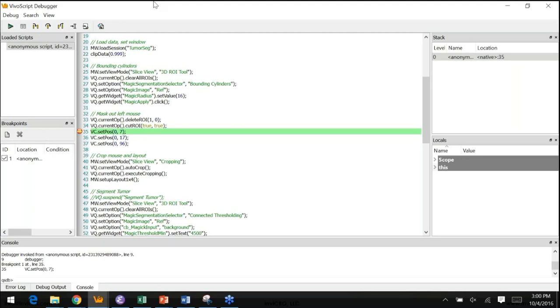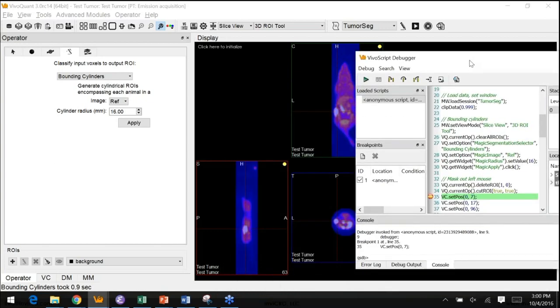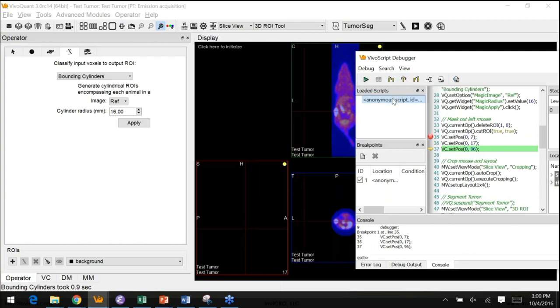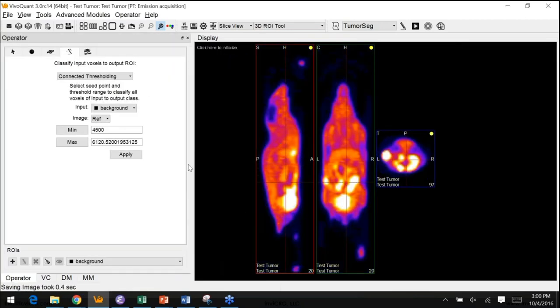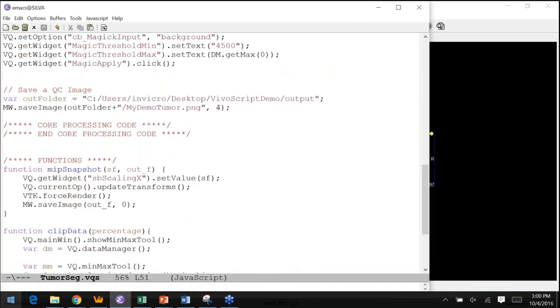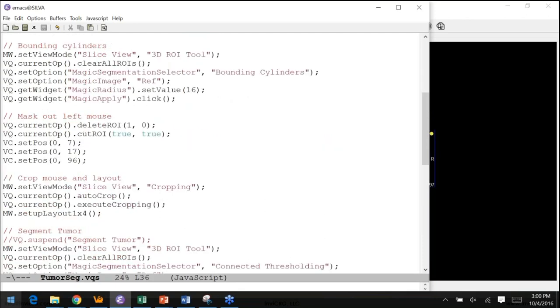Okay, it paused here. Made it really tiny. So that's actually looking pretty good. It set that part in there. Let's see what happens to the other ones. Step over, up. You see, it's moving the crosshair. It's a little hard to see on the projector, but it's moving the same dimension. Obviously, that was my mistake here. You've provided the dimension as the first argument. They're all 0. So I can stop it, it'll continue running, and I can get rid of that debugger. It's a real powerful tool to figure out what's going on. You can see your variables, see what's in them, and figure things out that way.